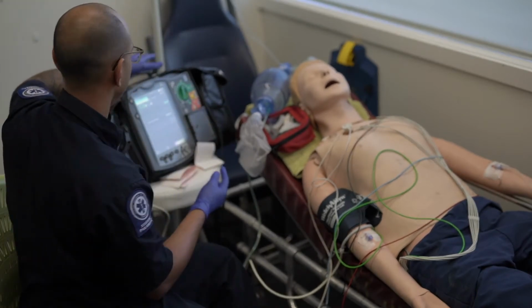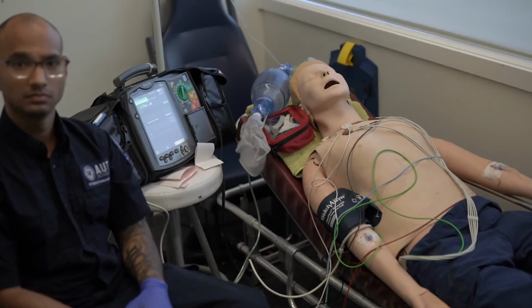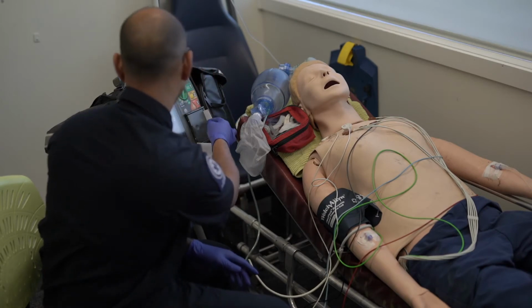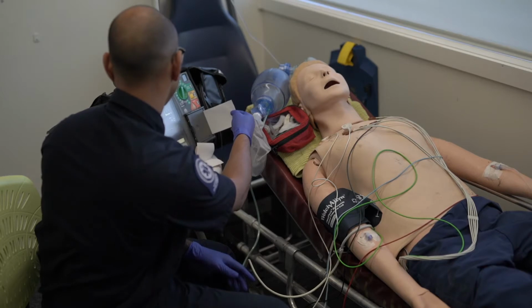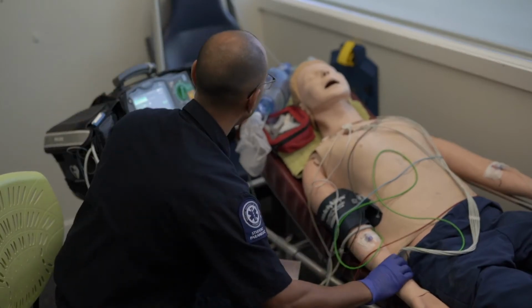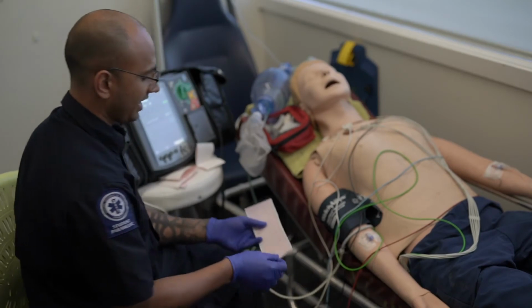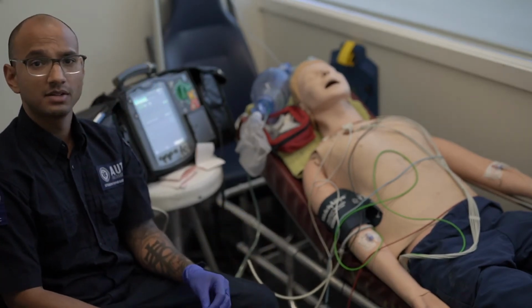Shock is delivered. Determine the rhythm and the level of cardiovascular compromise. As our patient still appears to be in what looks like VT. Hello, can you still hear me? Our patient is still unable to obey commands and still appears to be significantly compromised.